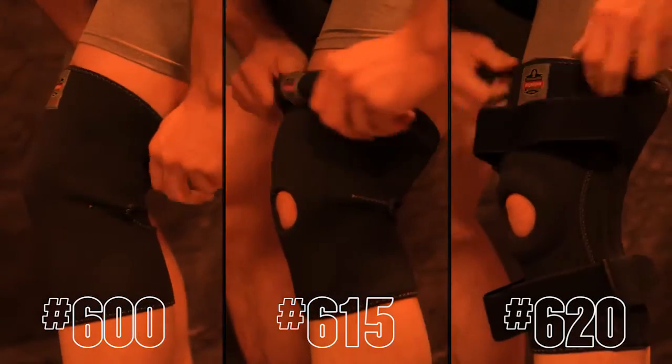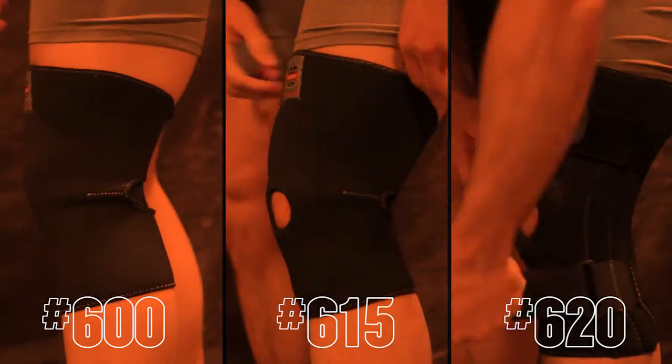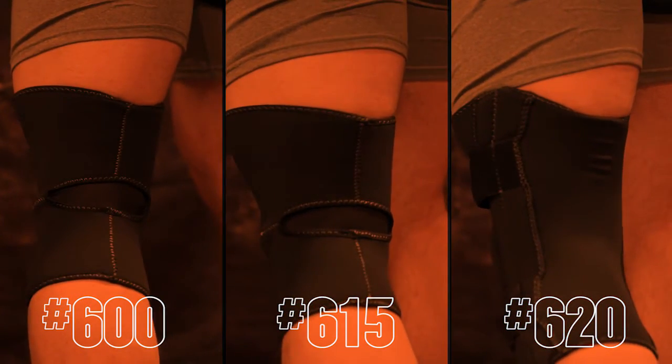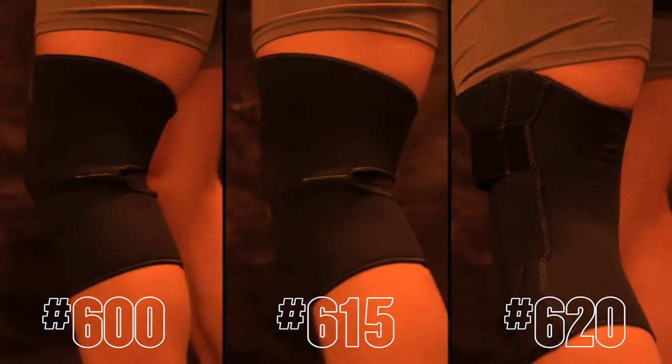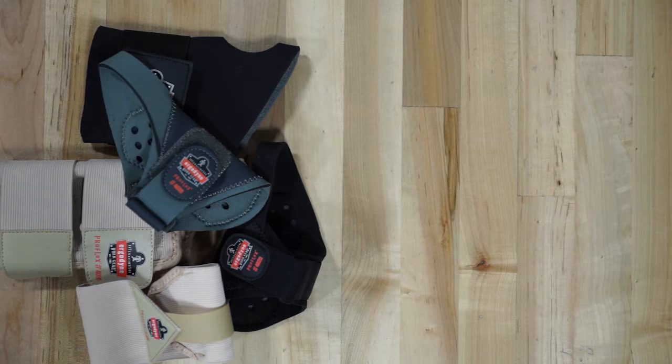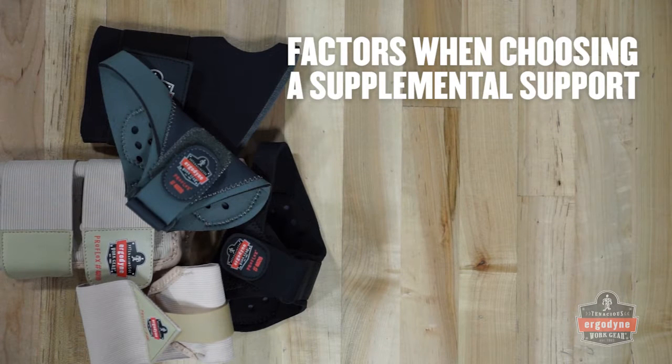Sore knees can turn any work day into a slow day. To help relieve joint discomfort, Ergodyne offers three different styles of ProFlex knee sleeves. All easily slip on under or over a pair of work pants to provide all day support and stability. When choosing a knee sleeve solution, the following factors should be taken into consideration.